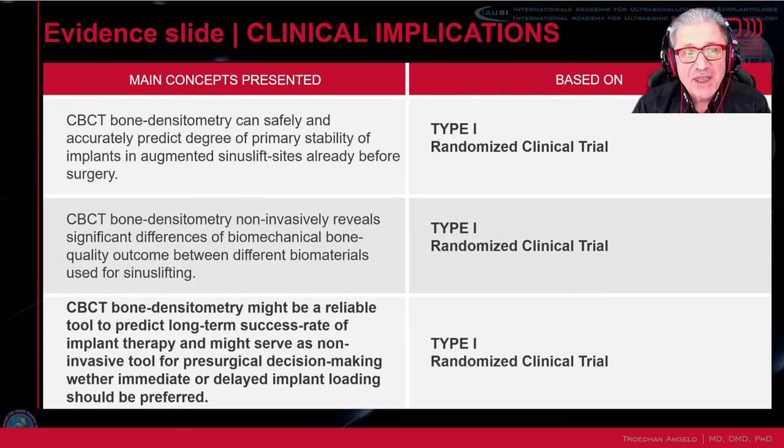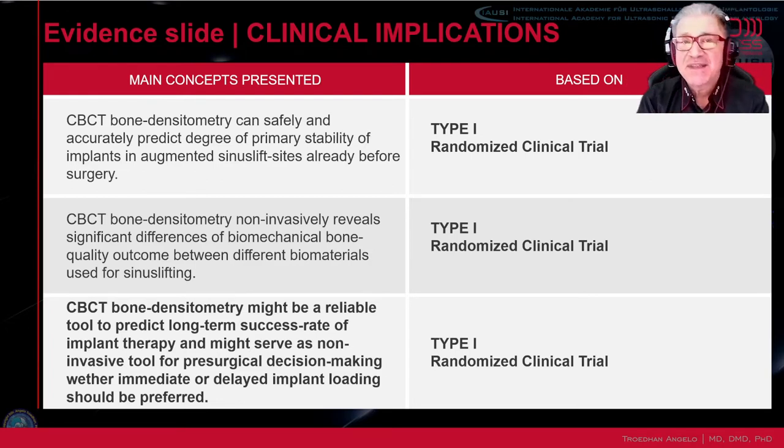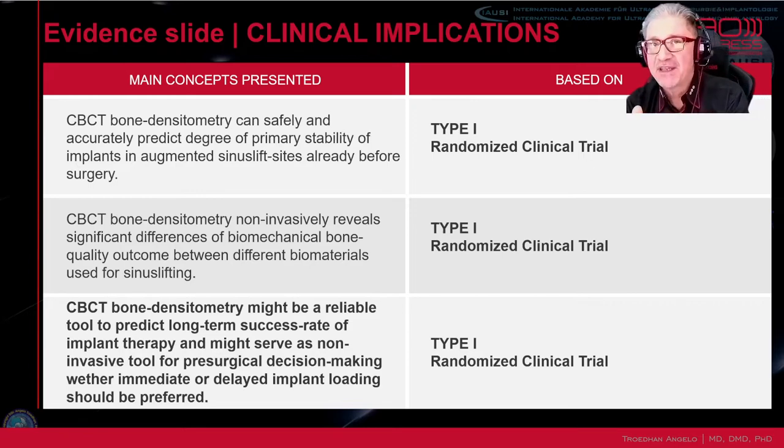Last but not least, CBCT bone densitometry might be, and is, a reliable tool to predict long-term success rate of implant therapy and might serve as a non-invasive tool for pre-surgical decision making whether immediate or delayed implant loading should be preferred. Of course, patients read Dr. Google. They know, okay, there are some types of implants where you can do an immediate loading after implant insertion. The problem is that patients don't understand that there is a correlation. If you have a poor bone quality, of course you cannot do immediate loading.